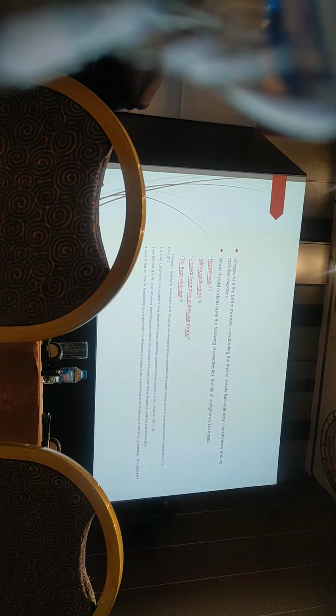And the last one is taller-than-wide, because sometimes a benign nodule also has an oval shape. It means that the anterior-posterior diameter is usually less than the transverse diameter, so the ratio of these two diameters is usually less than 1. If we find the ratio of these two diameters is more than 1, we will suspect this nodule has the possibility of malignancy.